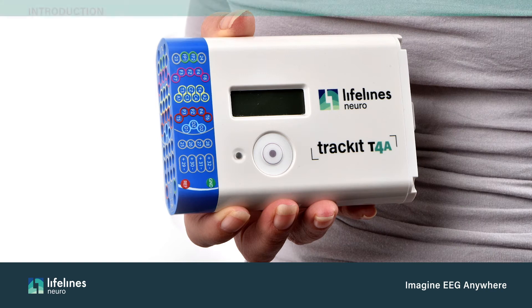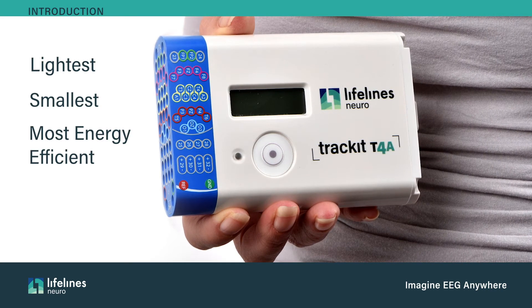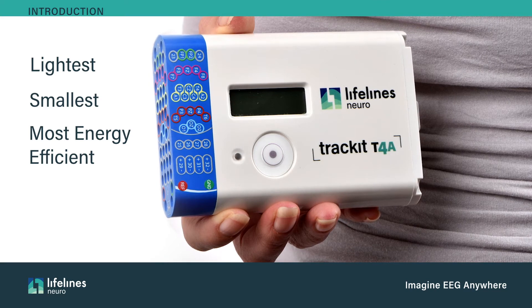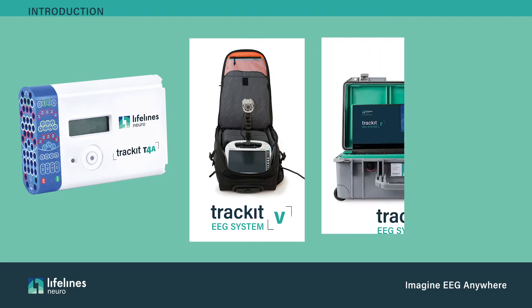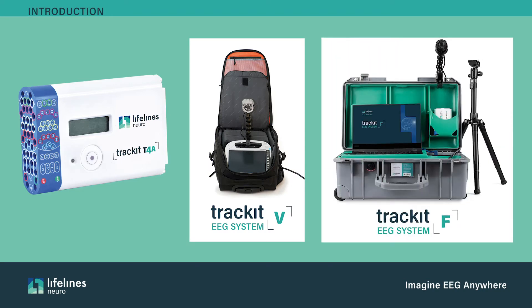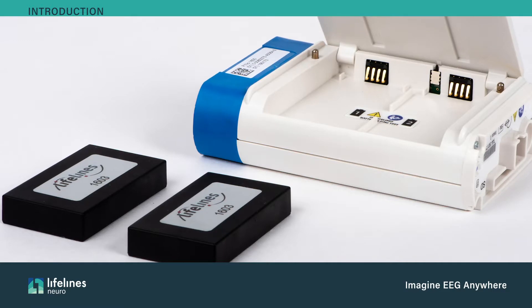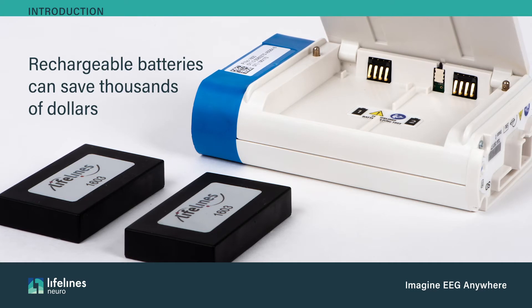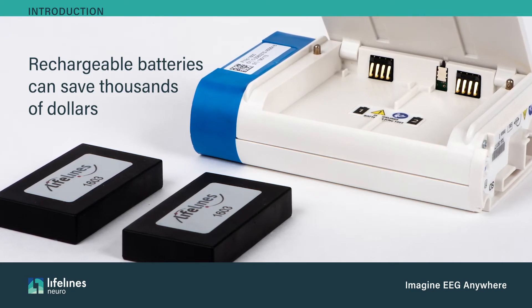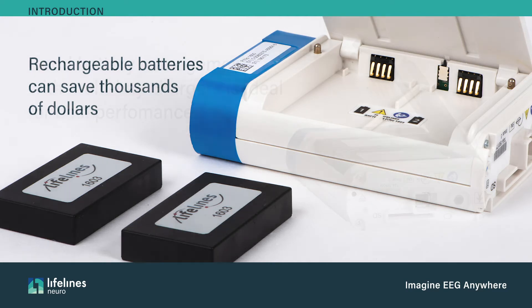The Trackit T4A is the lightest, smallest, and most energy-efficient ambulatory EEG amplifier from Lifelines Neuro. It can be used with Trackit V and Trackit FEEG systems. The T4A is supplied with two rechargeable lithium-ion battery packs, enabling users to save thousands of dollars per year compared with the lithium or alkaline batteries in the Trackit Mark III and other ambulatory EEG devices on the market.